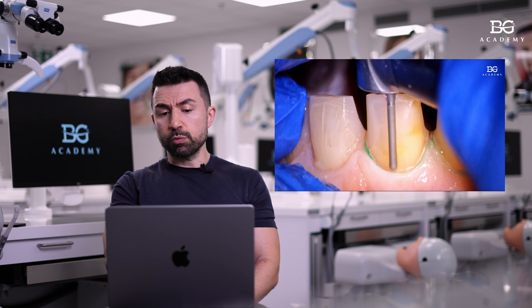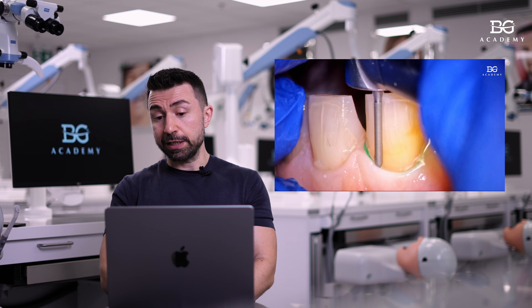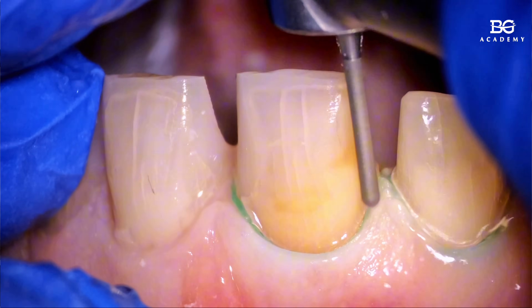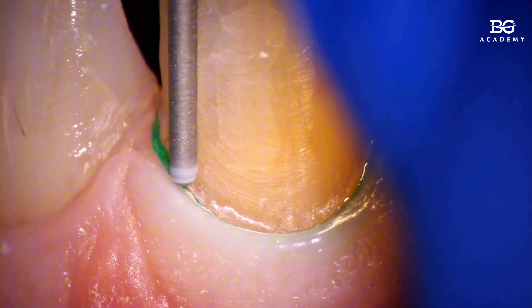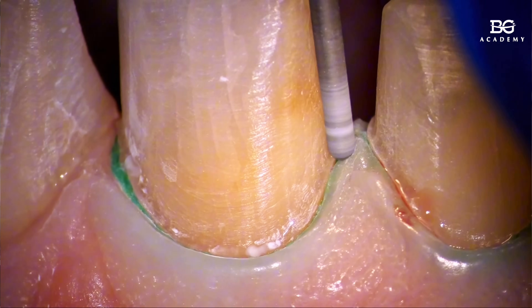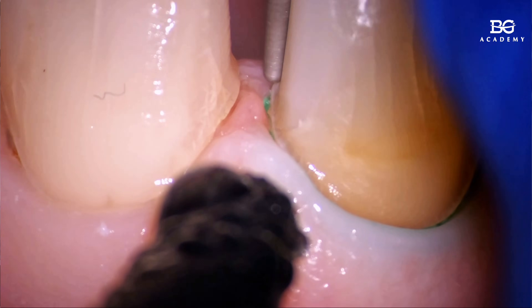This is the trick. You can see the almost final stage of preparation. I was using an electric motor with an increasing handpiece and a red diamond bur. That's why you may not see any bleeding. We spent a lot of time developing this protocol for our colleagues, because there are many questions about how to make preparations with almost no bleeding when we move our finish line into the sulcus. The key is low speed electric motor — that's essential — and a red diamond bur. You can also see a fluorescent filter, a fluorescent light from the microscope. This fluorescent light shows me where the composite is, so I'm able to do precise preparation on the mesial side, keeping my margin on the tooth, not on the composite.